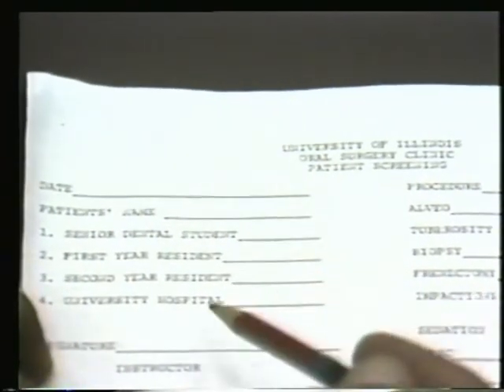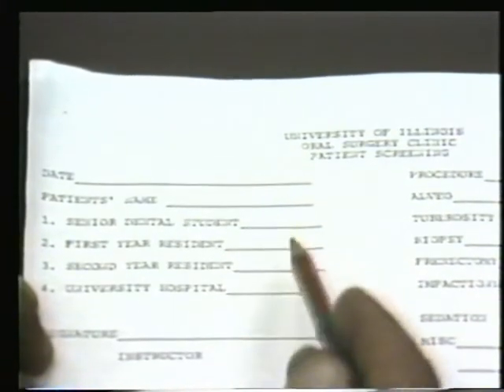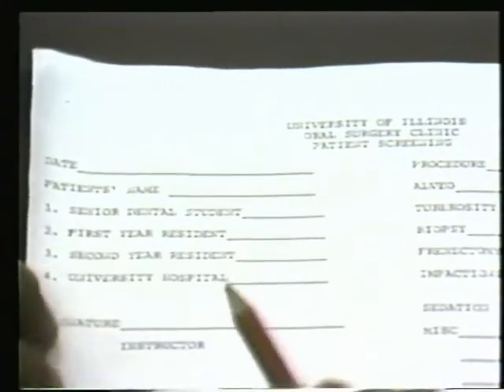This is a patient screening form for patients with complex procedures who need to be referred to advanced students, either seniors or first or second year residents, or to the university hospital. These are the post-operative instructions in English and also available for Spanish-speaking patients.